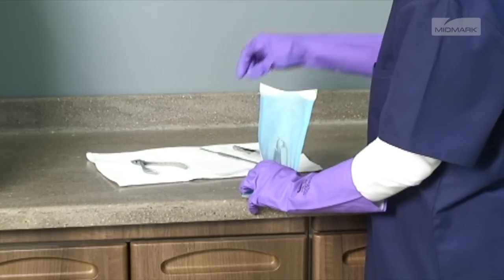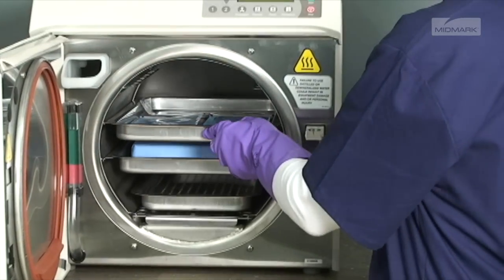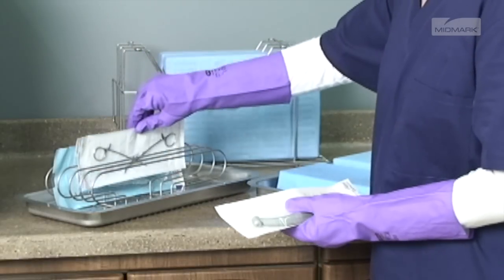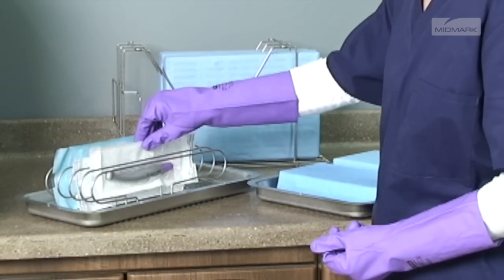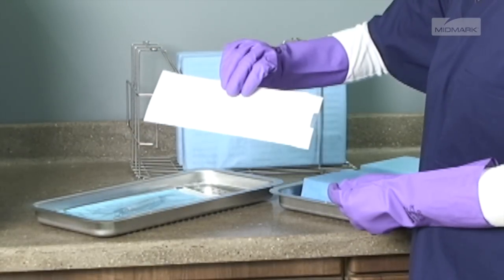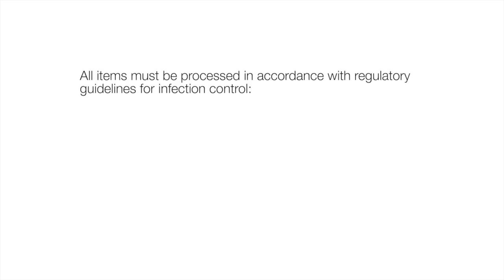Pouched items should be loosely packed. Handpieces and instruments must be single height loaded, not piled or stacked, to permit proper steam flow and penetration to the items. The preferred orientation for pouches is resting on their edge, best accomplished using the Midmark pouch rack accessory. If using the standard tray, pouches should be placed paper side down. All items must be processed in accordance with regulatory guidelines for infection control.